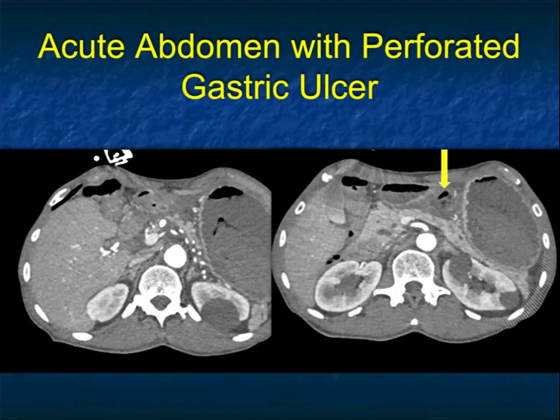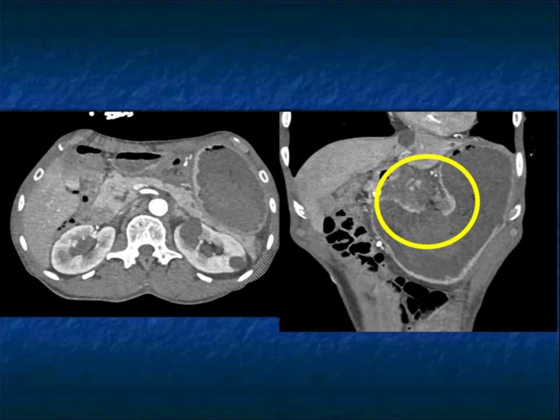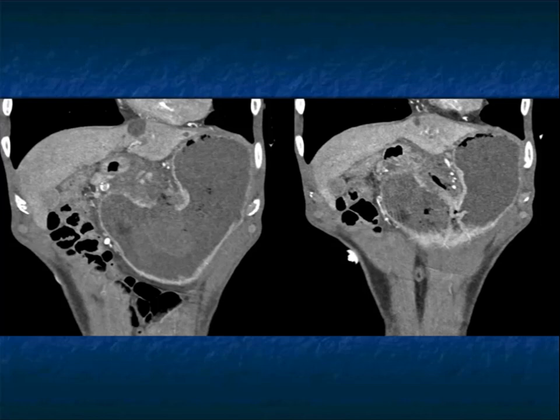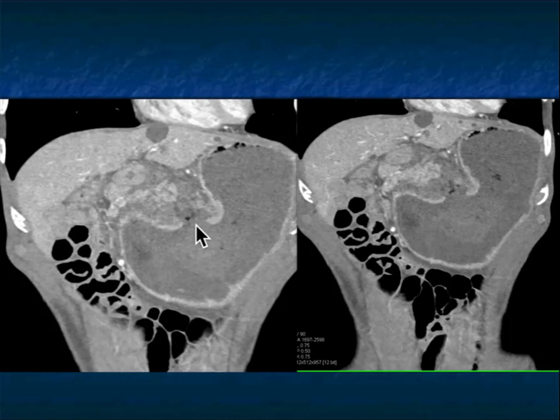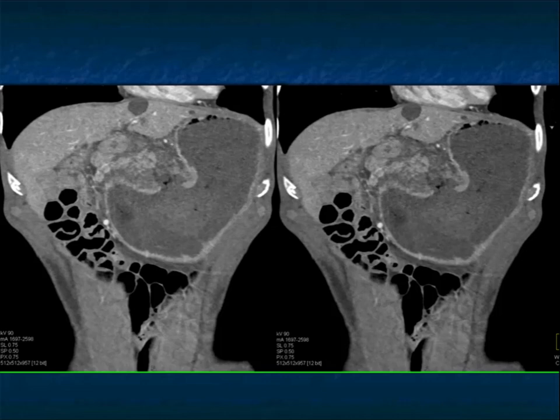You can see the stomach is distended with high-density material, so I'm suspicious there's a bleed. You then see this air pocket near the body of the stomach at the arrow. Looking at the coronal views, which open up the stomach, can be very helpful. Here it's much more obvious — you see the patient's stomach wall, the break in the stomach wall, the break of the mucosa, and the air bubbles. That's a patient with an ulcer with perforation, very nicely shown on these coronal views. When there's no large mass present, this probably is benign ulcer disease. When you don't see a mass or wall thickening, you can go with benign — but of course the patient will end up with endoscopy, so you'll know for sure.